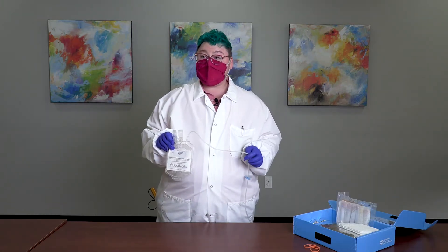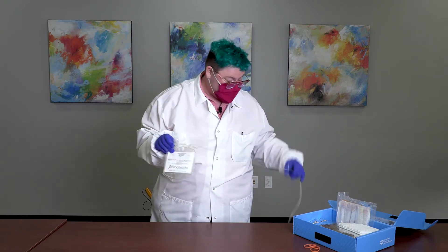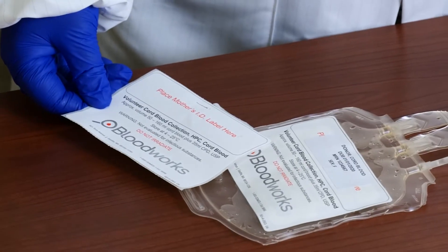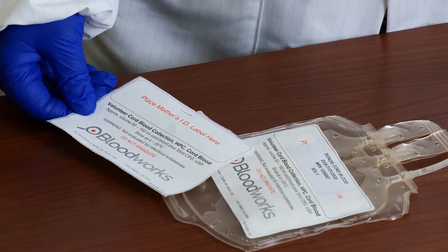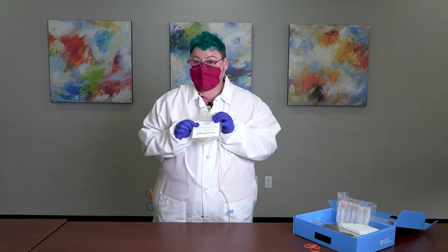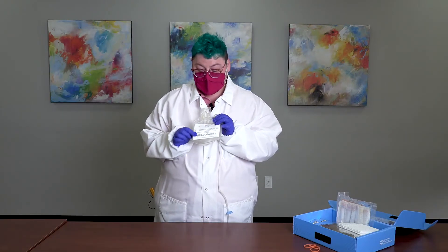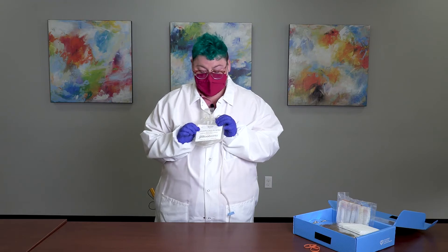Once your cord blood has been collected, two tight knots added to the tubing line, and the needle discarded, verify that the base label and the patient's hospital label are on the collection bag. Without this information, we have to discard the unit and all your hard work will have gone to waste. Once the cord blood has been collected and the paperwork filled out, the donation is ready to come back to Bloodworks Northwest for processing at our cell processing lab.